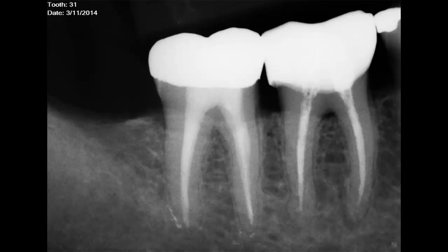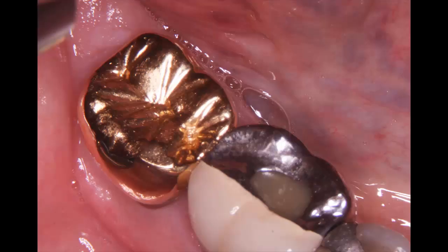beam CT recall. The PA radiograph you can see shows unremarkable findings with no 2D inference of a periapical radiolucency on either of the two roots that I treated. The adjacent first molar shows furcation bone loss and a small periapical radiolucency about the mesial root. The clinical microphotograph shows the nice gold crown restoration of the mandibular second molar and the porcelain fused to metal crown on the first molar with a very small occlusal outline. Very small occlusal outlines limit your ability to evacuate debris and irrigate, cleaning the canal system thoroughly.